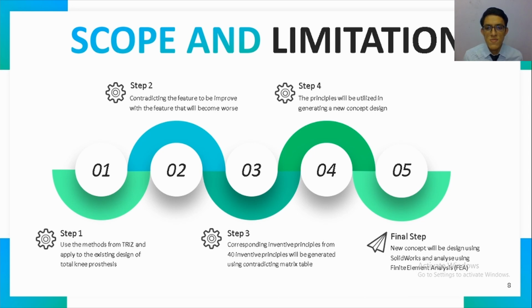The new concept will be designed using SolidWorks computer-aided design software. The design will be analyzed using finite element analysis with ANSYS software, then compared with the thesis from another FYP student.